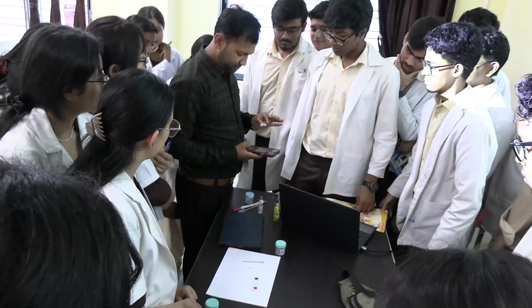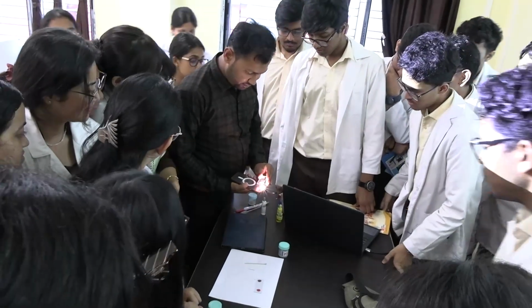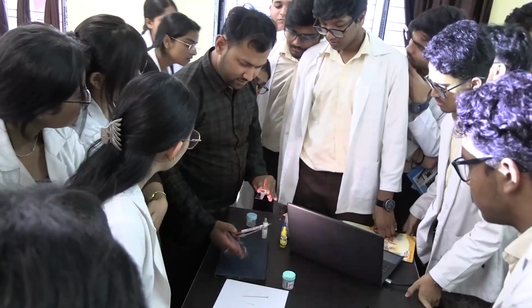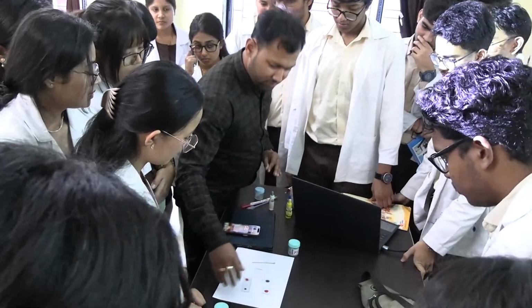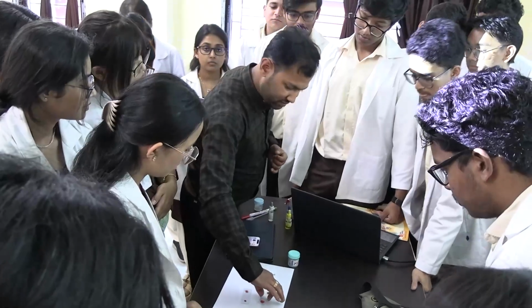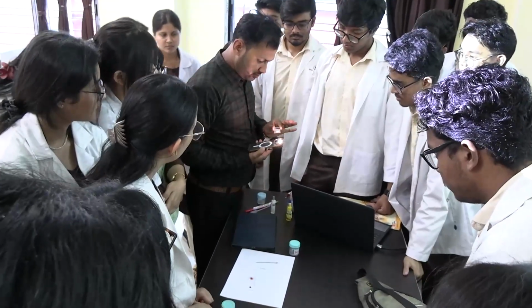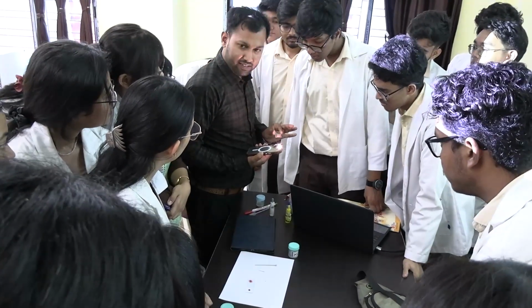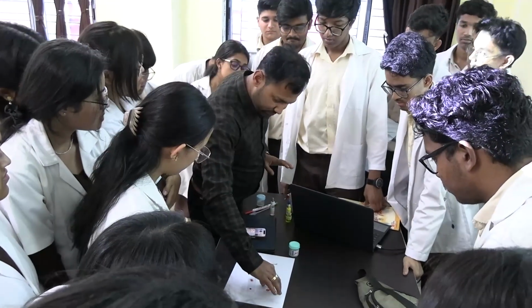There is some clumping in this person. Do you see the clumping? It will come in this one, not in the others. So this one was anti-D and this one is the control. The control should have been spread. Ideally it should have been mixed with the blood, but it was not mixed. When you rock it, the mixture keeps moving back and forth, but in the case of clumping, if it has formed once, it will not move.